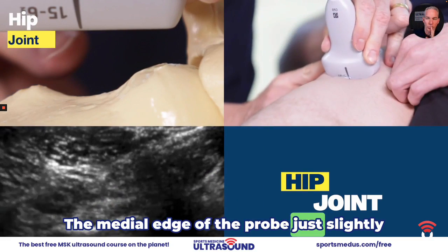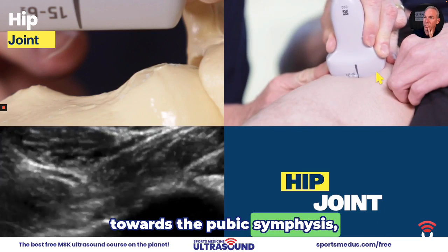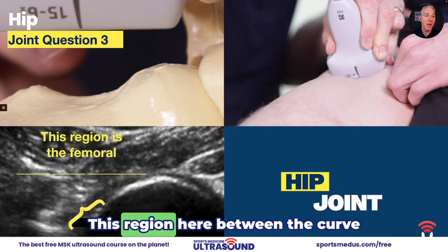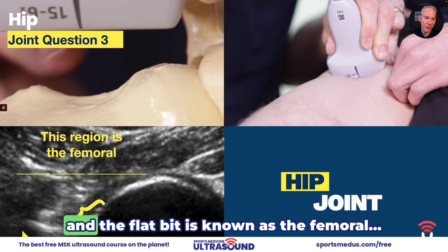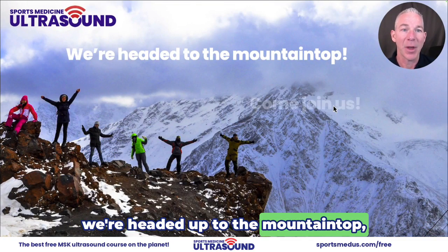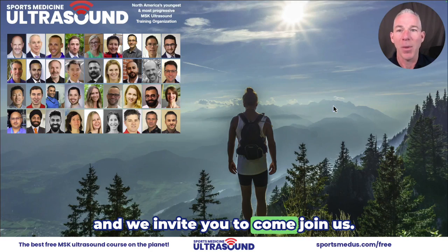The medial edge of the probe just slightly towards the pubic synthesis. My needle angle of entry is going to be right about here. This region here between the curve and the flat bit is known as the femoral. At Sports Medicine Ultrasound, we're headed up to the mountaintop and we invite you to come join us.